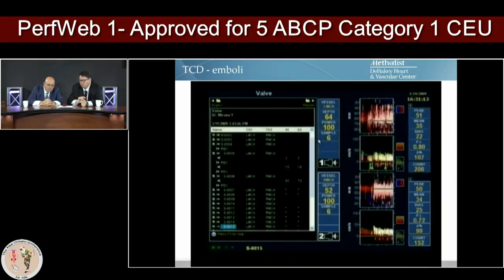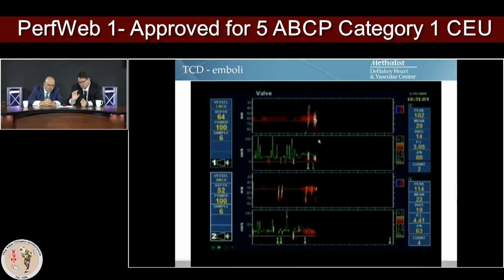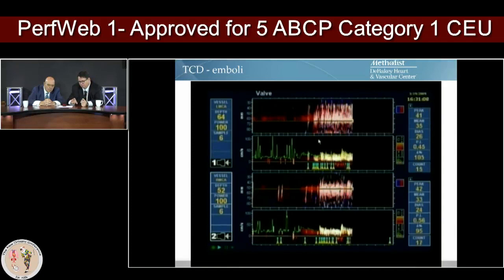really gorgeous. When the pulse first comes back, restoring the flow, it's stunning how the big air shower happens. Here you see your first heartbeat, and both hemispheres get flow back, and both hemispheres have a pulsatile shower of air. You can tell it's bilateral.